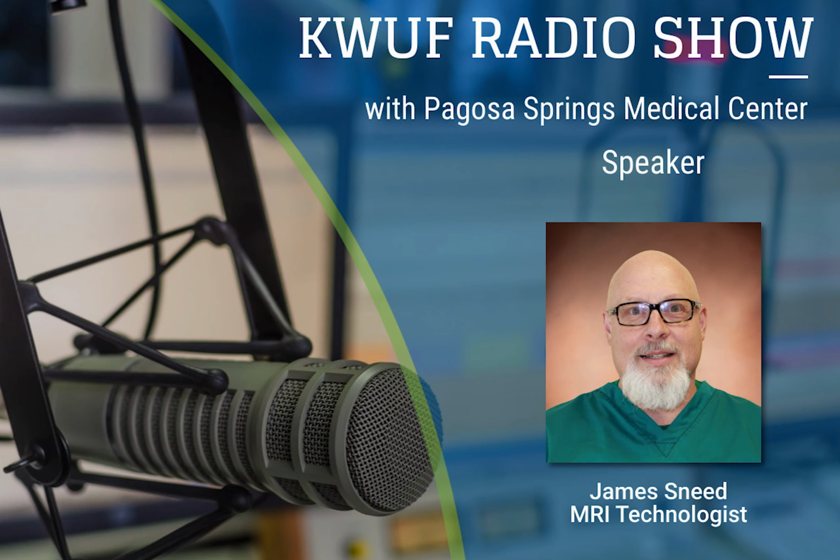Okay. So they're close. And James was showing me some photos, no identification or anything, but just, for example, you could see the cartilage around the knee joints and stuff. And you can see the ligaments. You can see all soft tissues, tendons directly. So for Dr. Bill, that's very helpful, I imagine. It is the gold standard for orthopedics. Yeah.